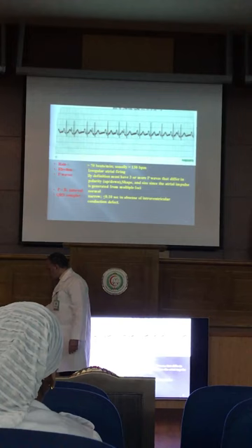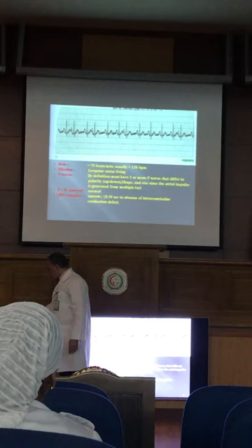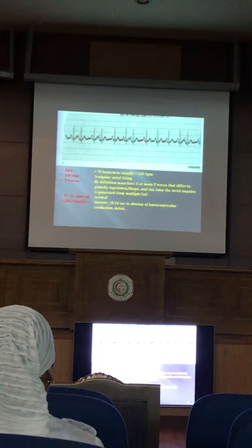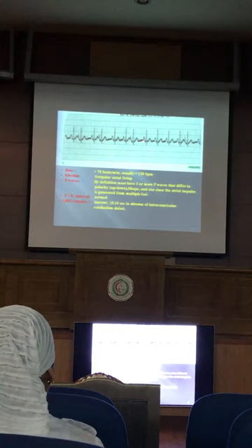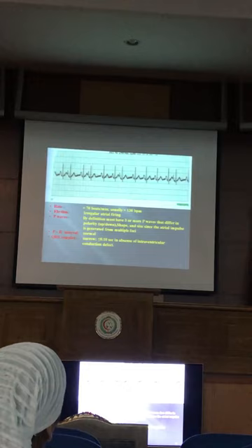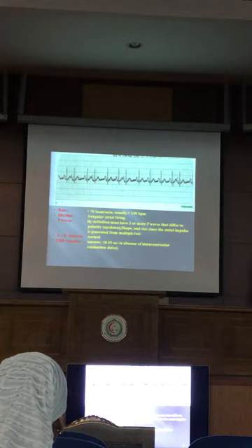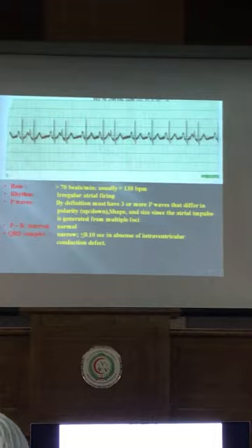P delta U — it is irregular, and there is one beat with different morphology that comes early. This is the normal duration between two normal beats, and this one comes early. This is premature atrial contraction — sinus rhythm with premature atrial contraction.